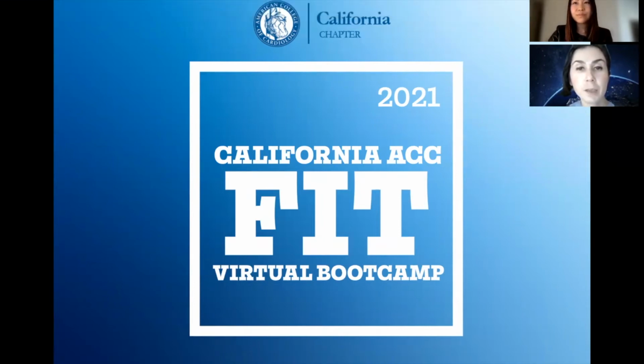So let's get started. All right, so the first question that came in is, could you talk about troubleshooting TVPs when Telemonitor shows lack of capture? How would you go about adjusting the TVP, which is the transvenous pacer, and what do you look for? And Dr. Held replied, most commonly, lack of capture with TVP indicates that the tip of the device has moved and requires repositioning. Very rarely would this represent a true increase in capture threshold unless the device has been in place for many days. Regardless, I always start by increasing device output and assessing for improvement in capture consistency.